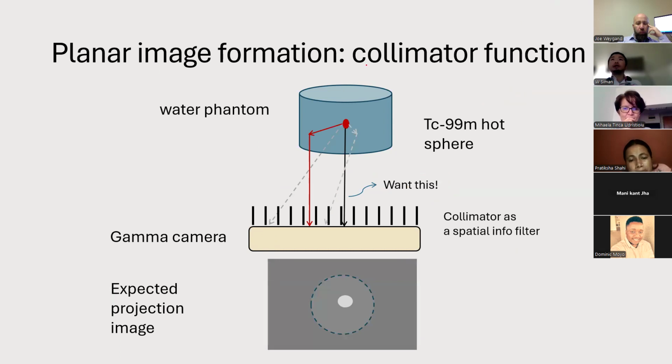The first thing we do is put a collimator. The function of the collimator is to absorb the gamma rays that come at an angle. It doesn't work 100% of the time. You cannot really stop all photons, but it minimizes the intensity of the photons that come at an angle. So in this case, we've removed the gamma rays that come at an angle.